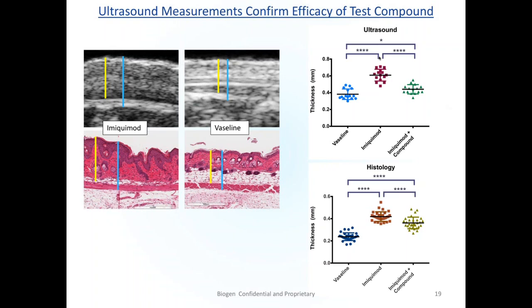What we figured out was that if we worked out when the interesting time points were for our imaging, we could limit the hair removal. For example, in the first model, the genetic model, we could capture images once every couple of weeks or once a month and acquire a lot of data that was really useful for our studies. So you don't have to do all that frequent hair removal. And for the last model, it's very short, so you do the hair removal once and never again.